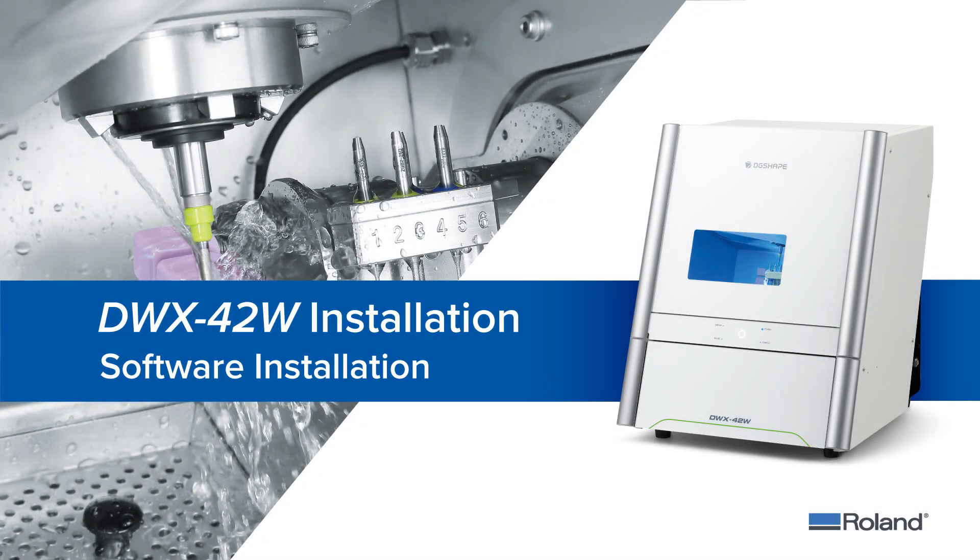This video will walk you through the necessary steps to install the driver, vPanel software, and a digital copy of the user manual for your DWX-42W wet dental mill.